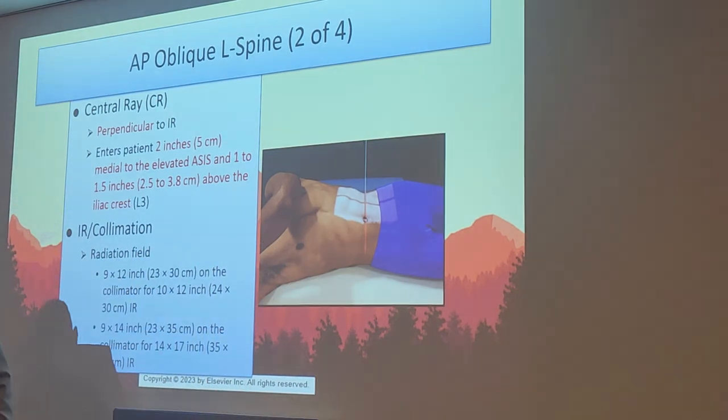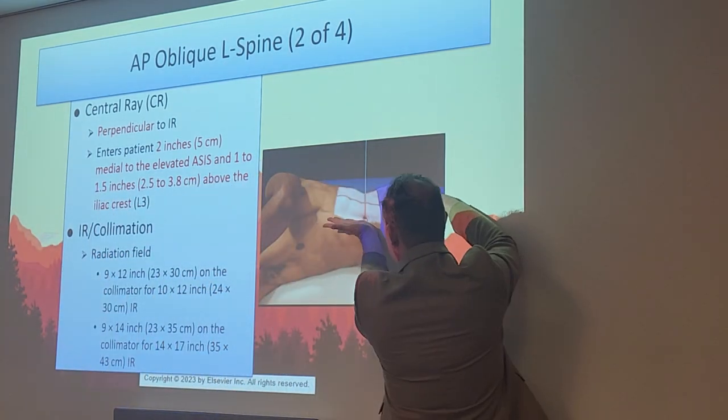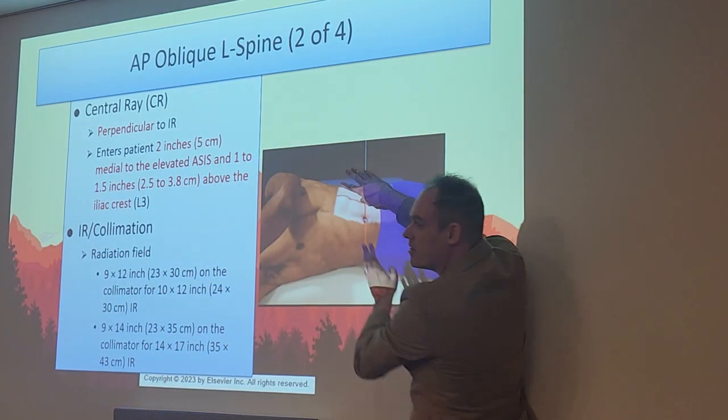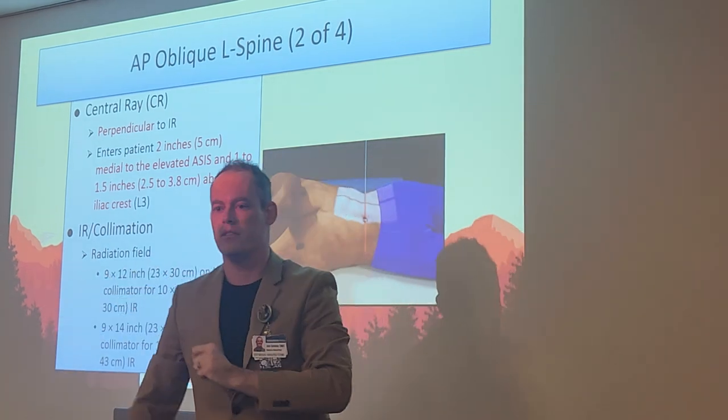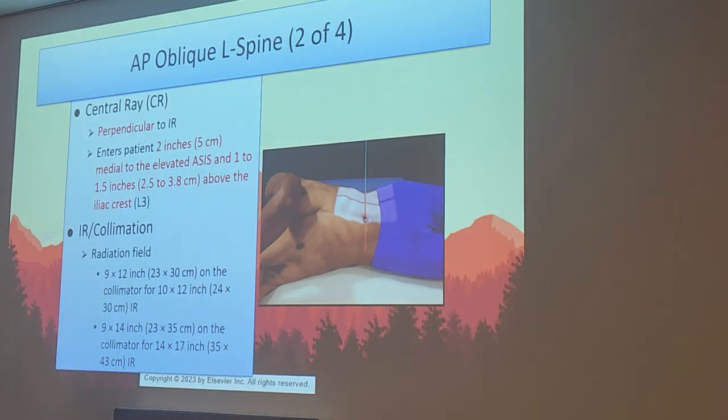Or something else you can do, as appropriate as possible with your patient, of course: put one hand on the stomach, one hand on the side, bring your thumbs together. That's your centering point as well. Another little trick you can do. Make sense? Now your collimation should be at minimum a 9x12 on 10x12.